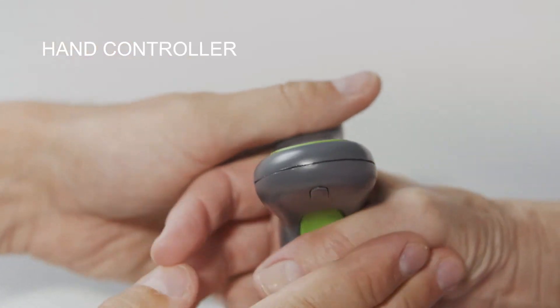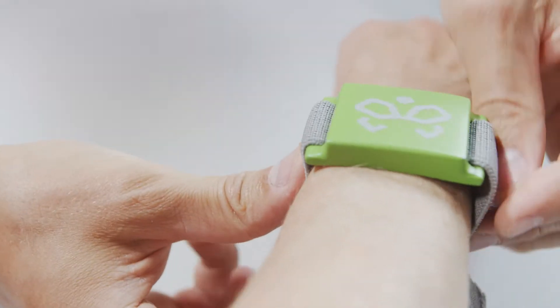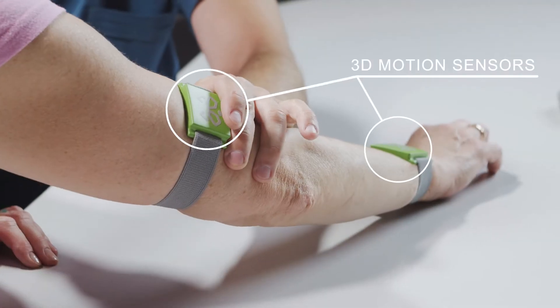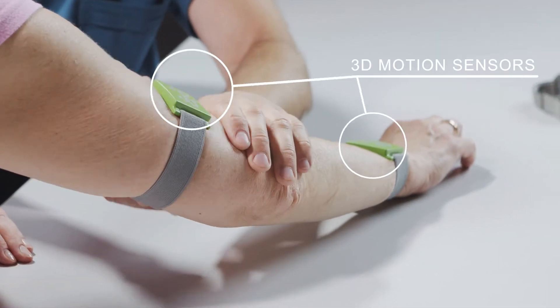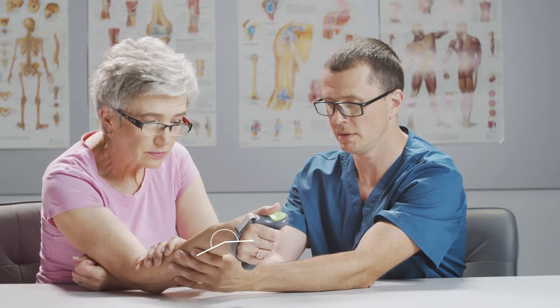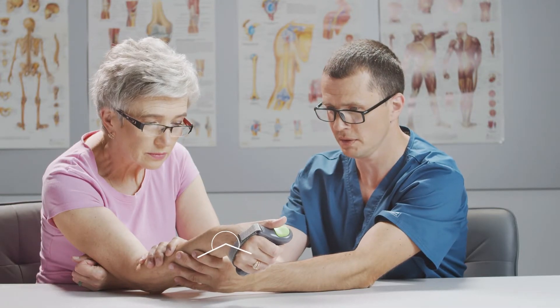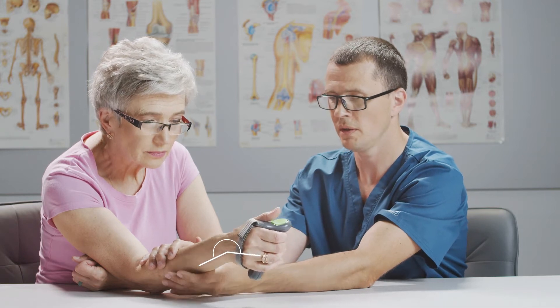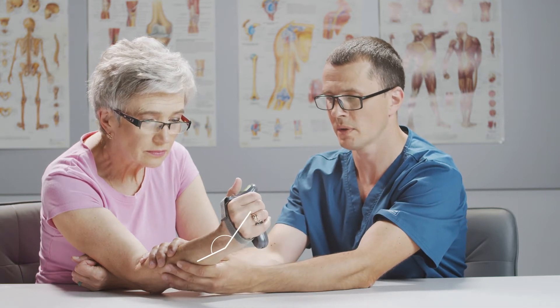The main components of Raccoon Recovery are a handheld controller and a 3D motion sensor that work without cameras or any other additional equipment. The controller is both a manipulator for video games and an assessment tool at the same time. The design of the controller allows measurements for a wide range of hand parameters, including angles and volume of movement.